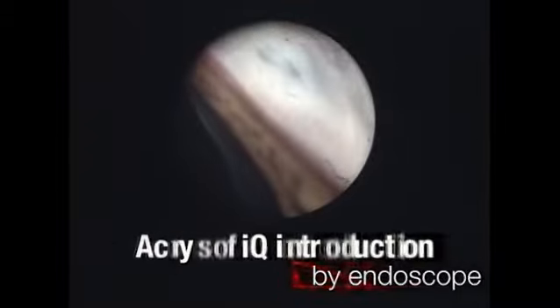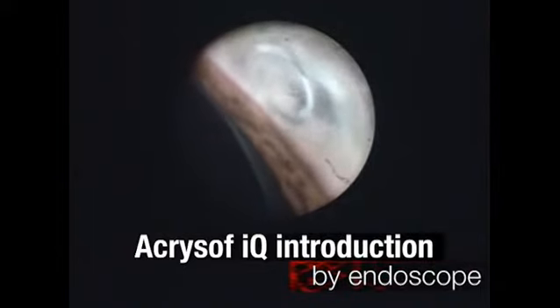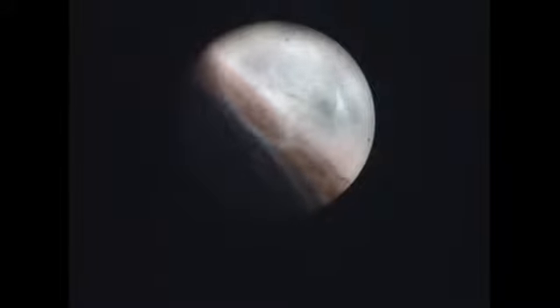We can observe the injector penetrating the corneal incision. The intraocular lens to be introduced is an Alcon aspheric single-piece lens. The haptic loops may be verified even before they reach the anterior chamber. The IOL is then positioned below the anterior capsule and, as it unfolds, it takes its place in the capsular bag. The haptic loops loosen progressively from the optical body, principally through maneuvering and viscoelastic accommodation.